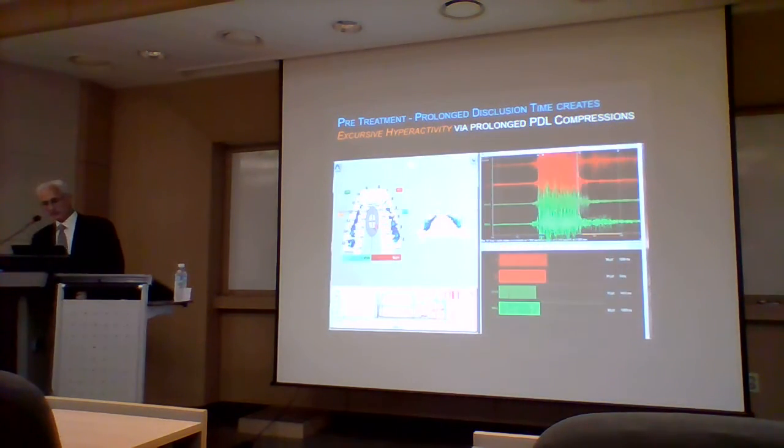So when we look at her T-scan EMG, she bites down fully, she holds her teeth together, she slides to the right, and again, the right side is controlled by the working side posterior teeth, that's the blue quadrant. The anterior guidance doesn't really work until here, about 1.3 seconds after she starts sliding to the right. 디스크루전을 했는데 오른쪽 아래 하늘색으로 보이는 컨택이 많이 남아있고, 여기까지 이동을 했는데도 전치부 쪽에 빨간색으로 보이는 컨택이 나타나지 않는 걸 볼 수 있죠.